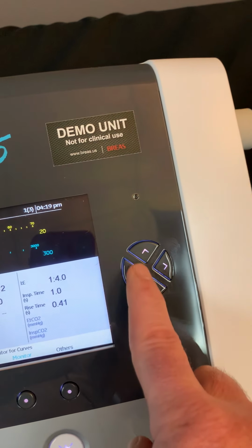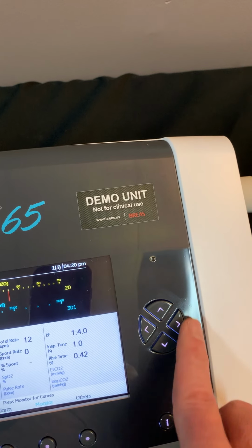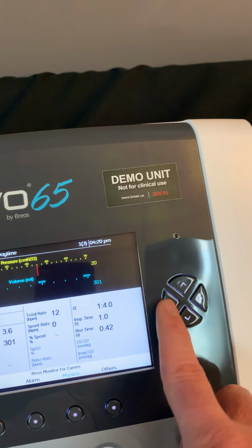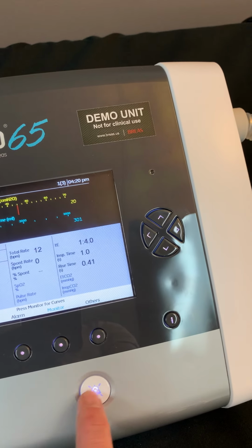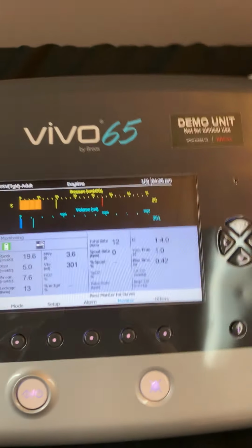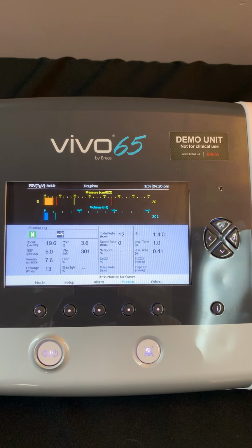And then over here, we've got 4 navigation buttons: up, down, left, and right. These will do absolutely nothing until you open a menu, and you're going to use these buttons to navigate through it. I've got a special I button here that I'll get to, and then we've got the alarm silence. All right, and that is basically the buttonology of the Vivo 65.